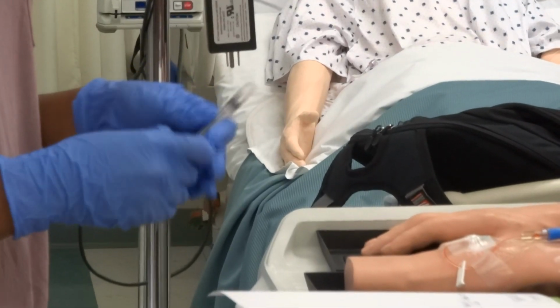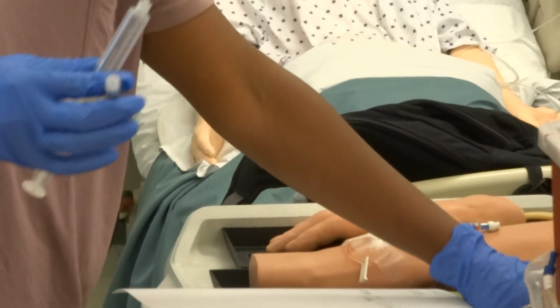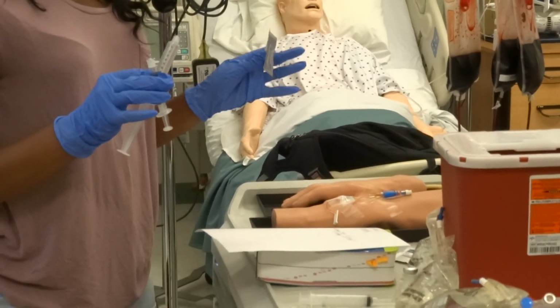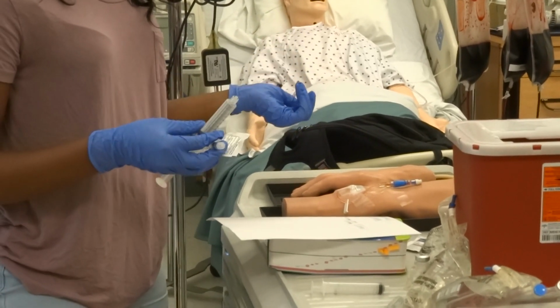So you have your flush, you have the Lasix, and you have a syringe, and you have alcohol, and you already checked everything in your drug guide, and you're ready to go, right? Come back inside the room.